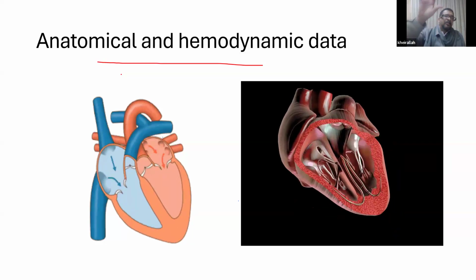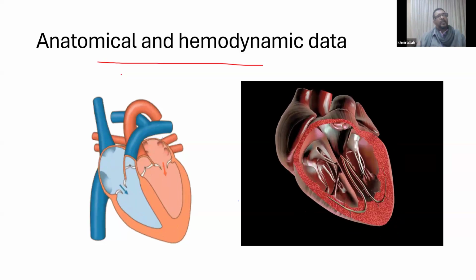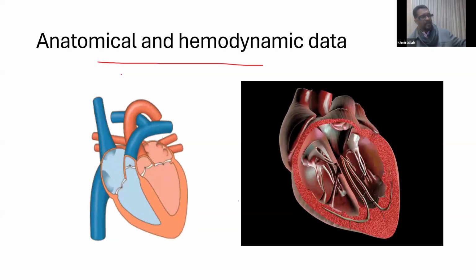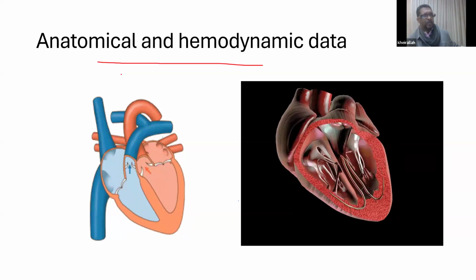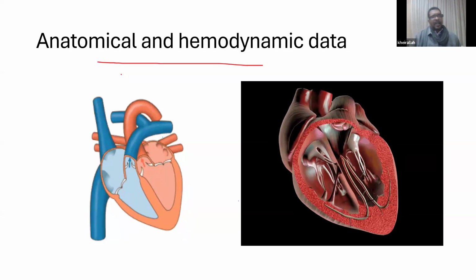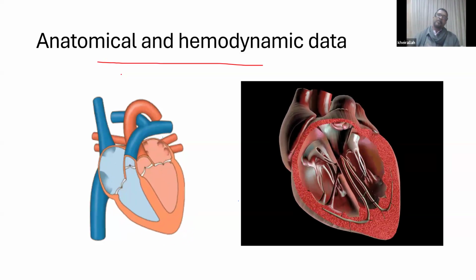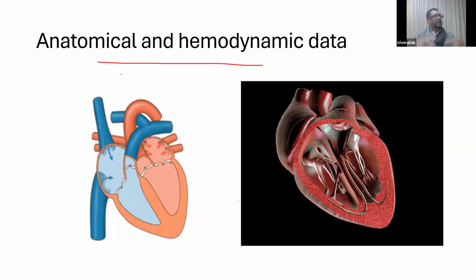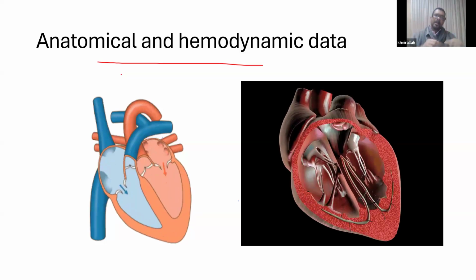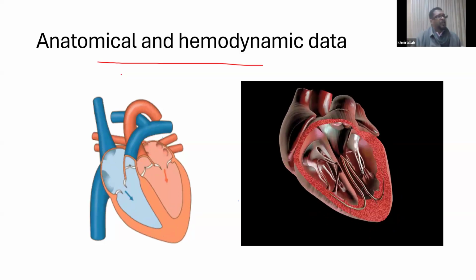Now if I tell you that I have a gradient across the aortic valve of 40 mean, the question is, you cannot answer what the problem is, because you should ask me how the aortic valve looks. If I answer that it looks severely calcific, degenerative with limited opening, then okay, this is the aortic valve morphologically, this is the gradient hemodynamically, so I have severe aortic stenosis.